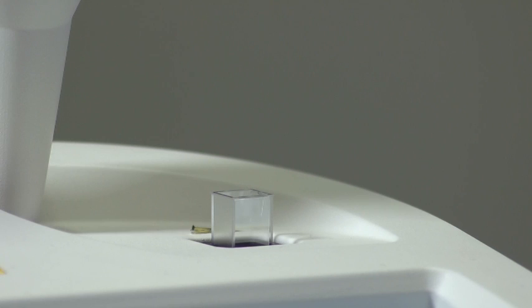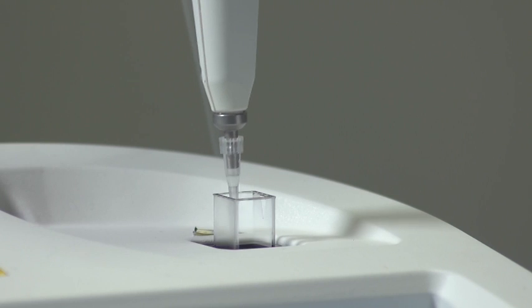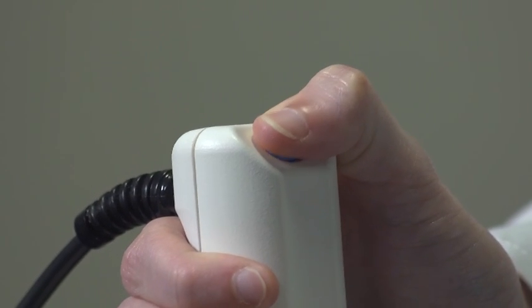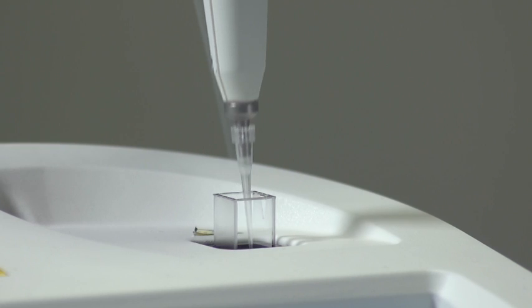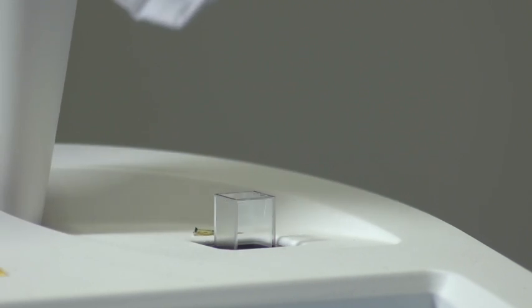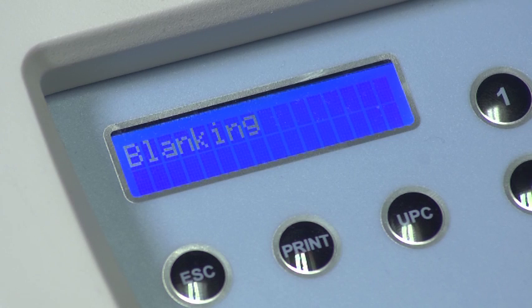To increase confidence in results, the analyzer has an expired reagent lockout system and a fail-safe start mechanism. This ensures the assay only begins when the reagents have been dispensed, removing the possibility of false starts. The accuracy and consistency of results is enhanced further by the automatic blanking and stirring feature, which ensures the reagents and sample are mixed together at the start of the reaction.